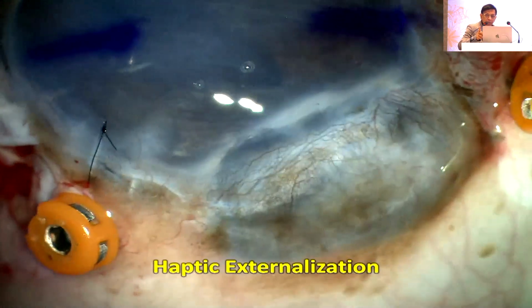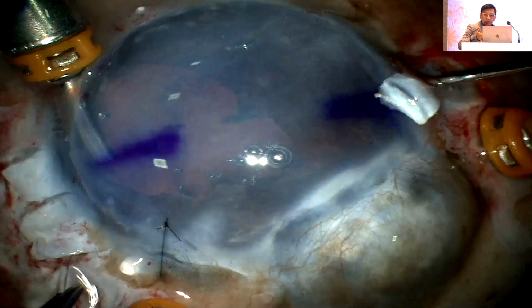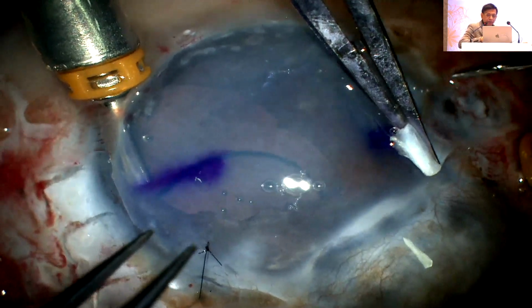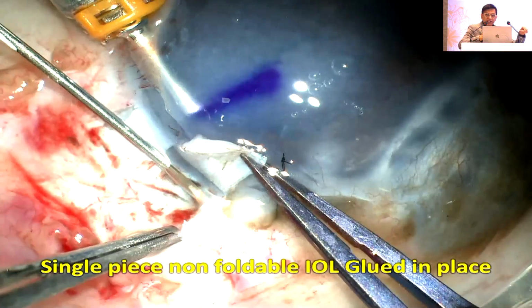Remember, this is a one-piece, non-foldable IOL. If I'm not careful, it will break. And if it breaks, I'm gone because I don't know how to explant it. There's no space for me. That huge ciliary staphyloma is my problem. So now, I've caught the haptic, and you can see that's the PMMA haptic. Be careful when you tuck, because you can't flex and tuck.